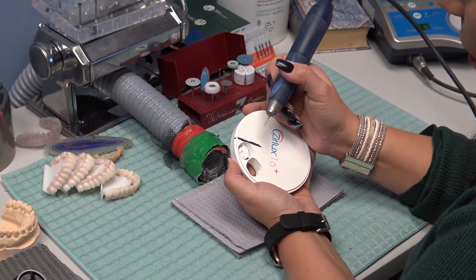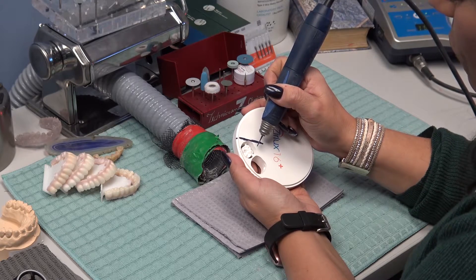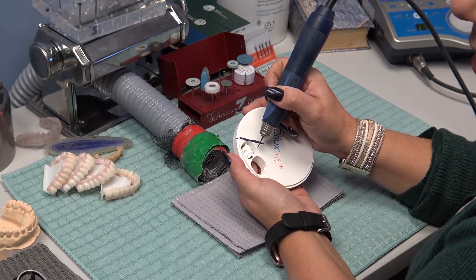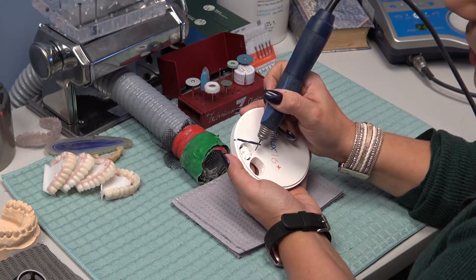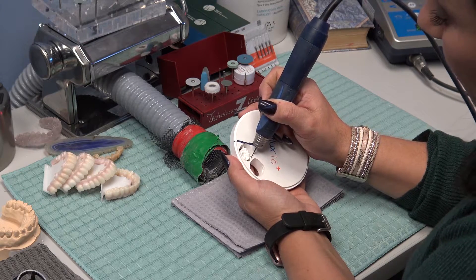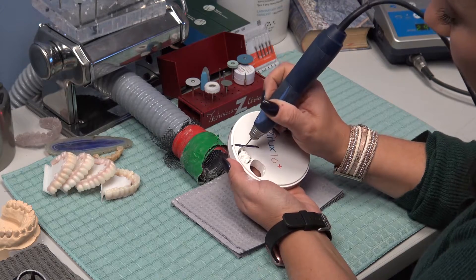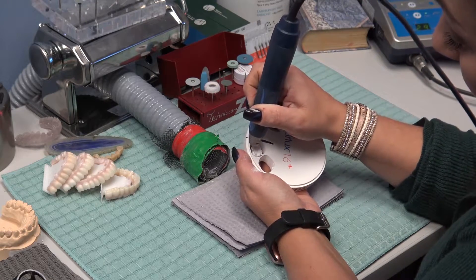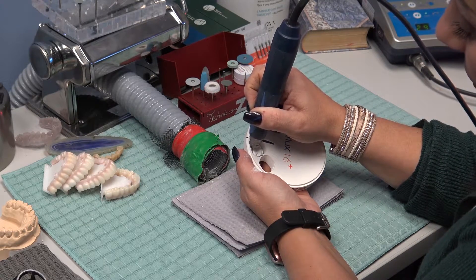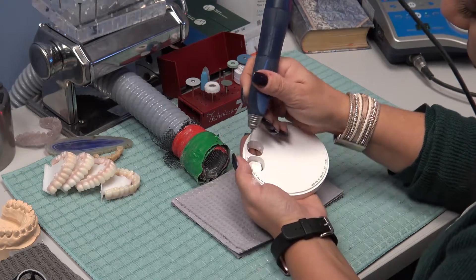The first thing we're going to do is use a carbide to cut the crown out of the disc. Normally I would use a high speed with a carbide, but in this situation I only have a low speed, so I'm using a low speed carbide — but I want to make sure I use it on very high speed. Let the tool do all the work. Gently cut through halfway through each sprue, starting with the occlusal up, then flip it over so the occlusal is down.